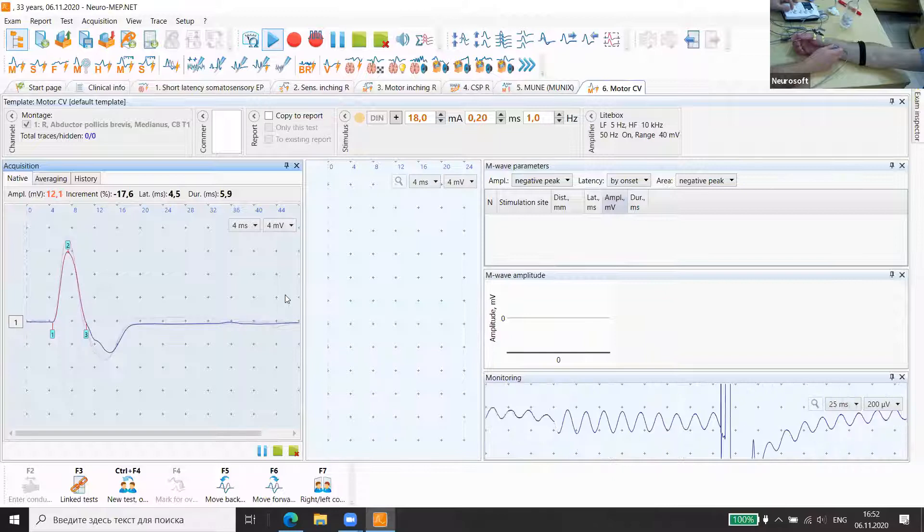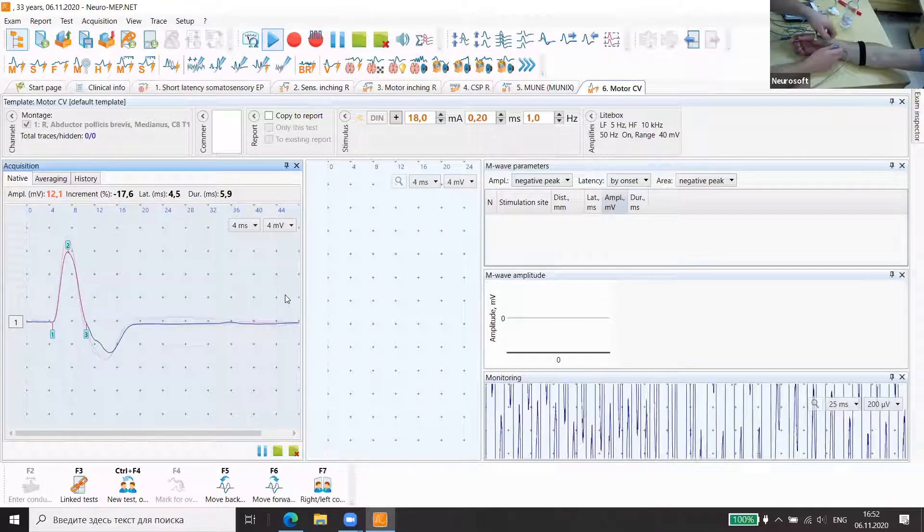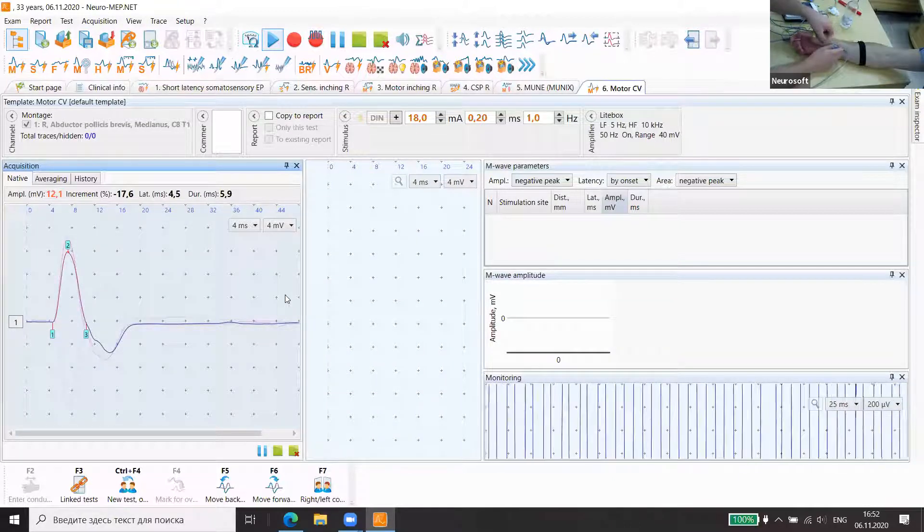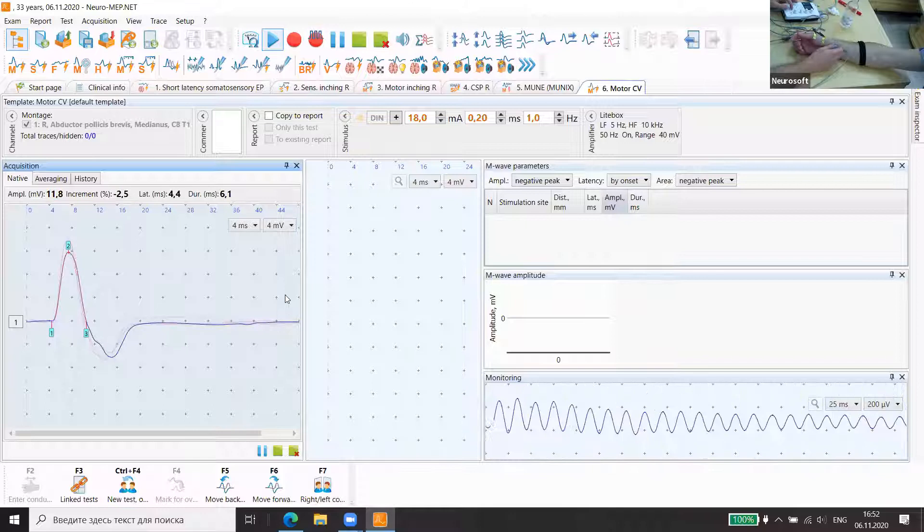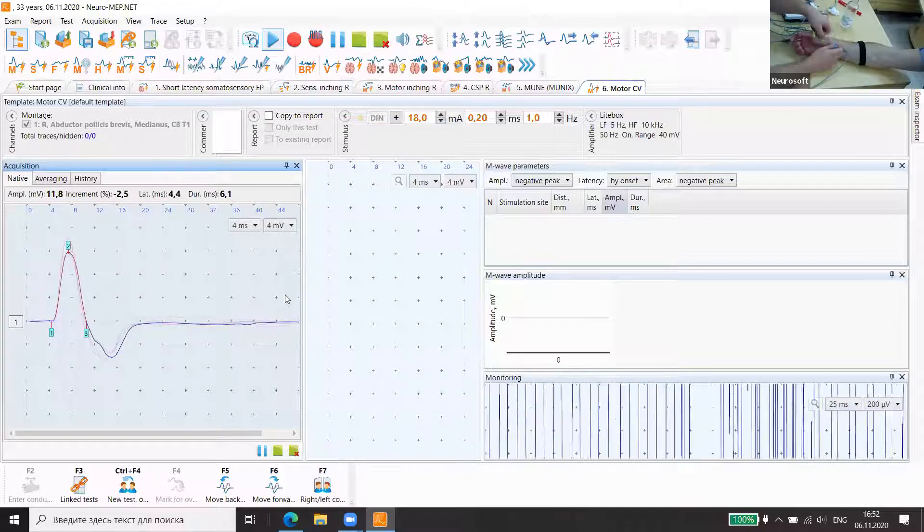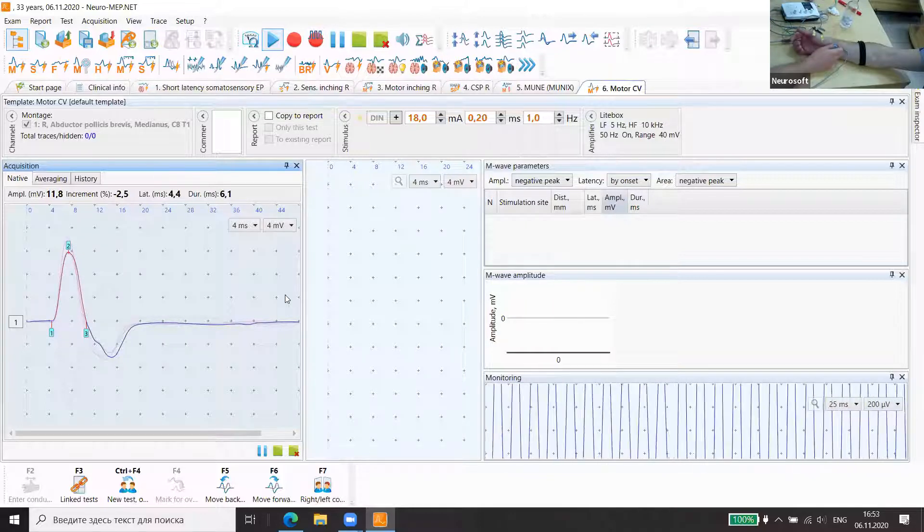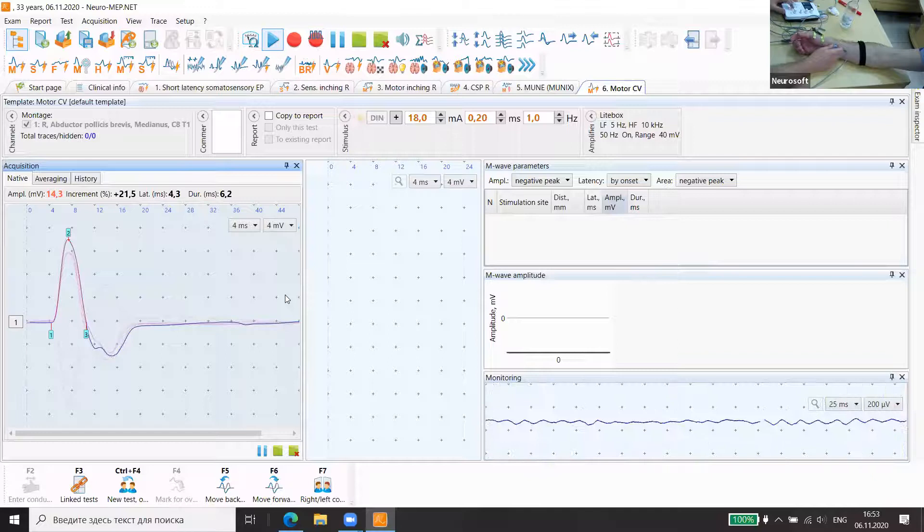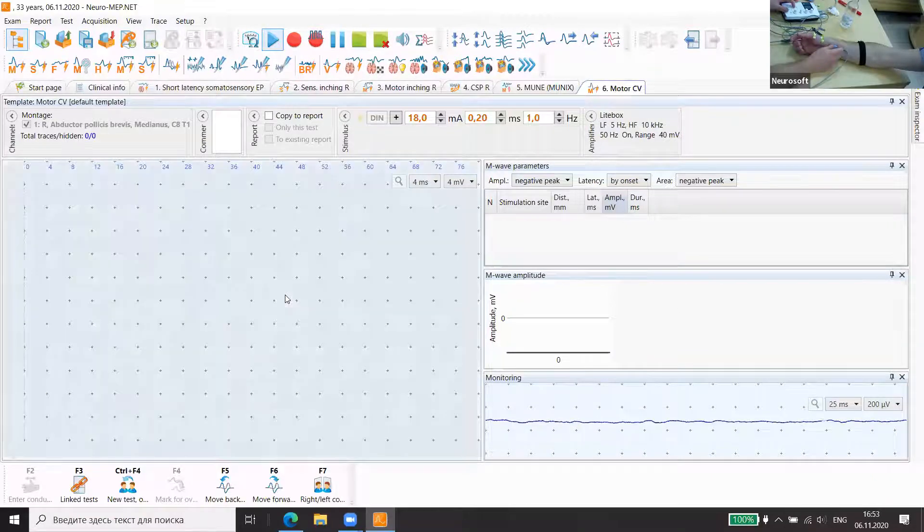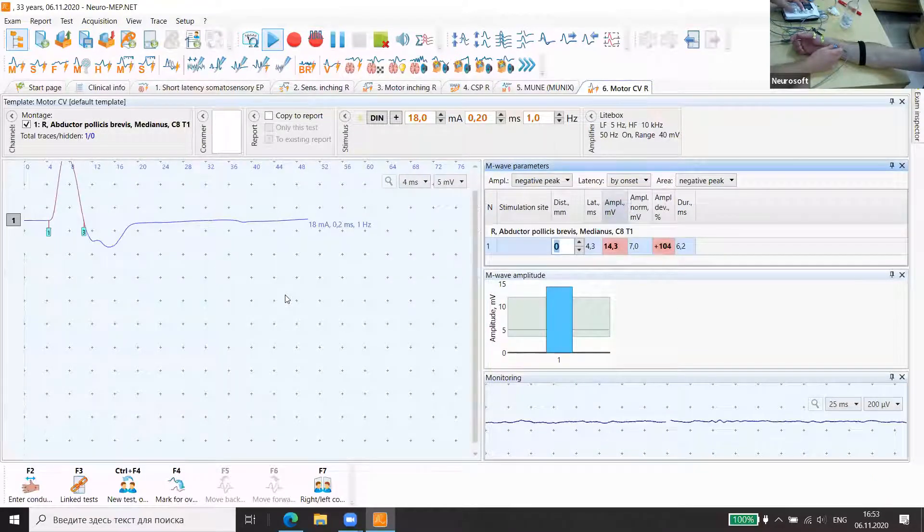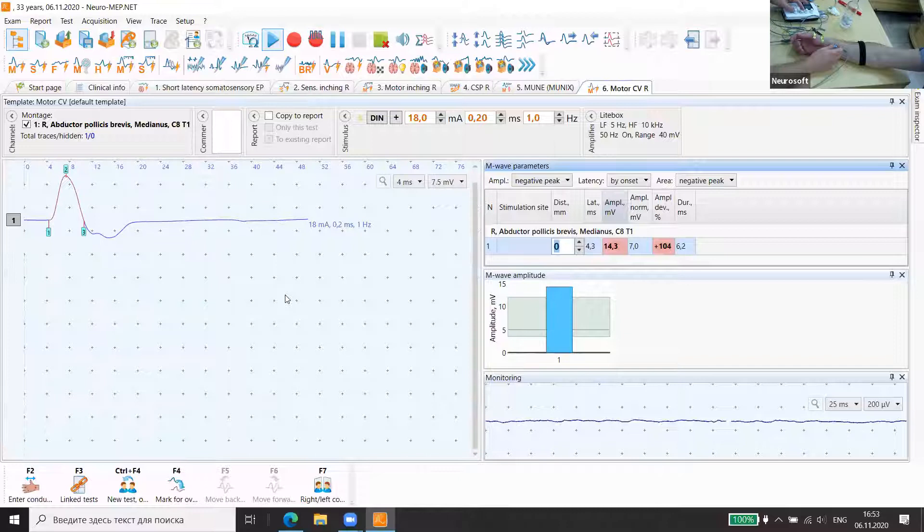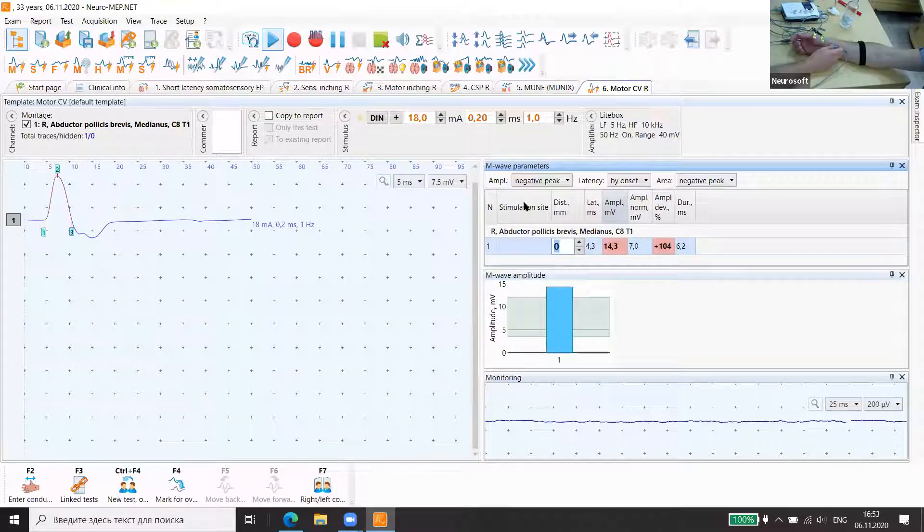We will use that one. It's quite high latency. Now we can go again to the MUNIX test.